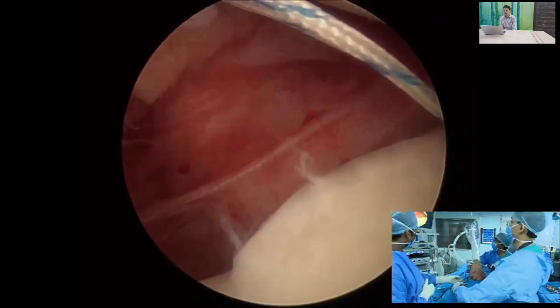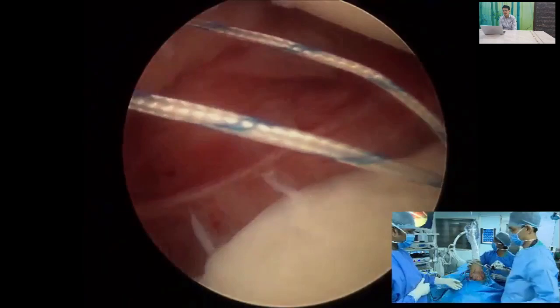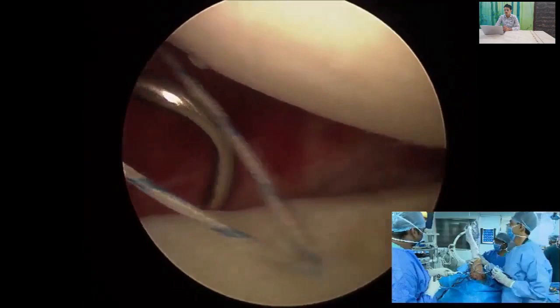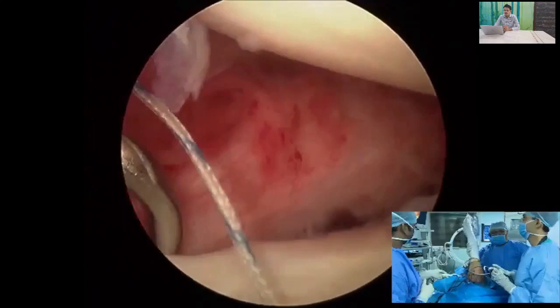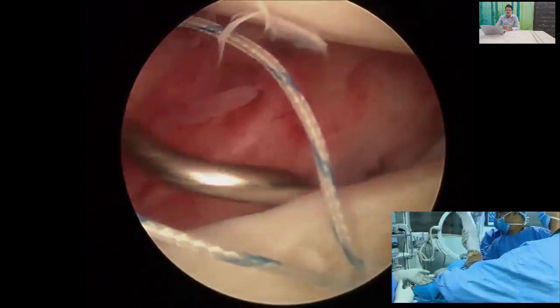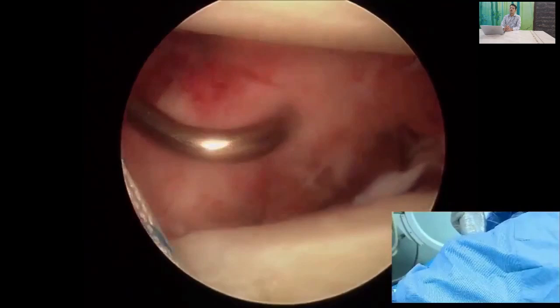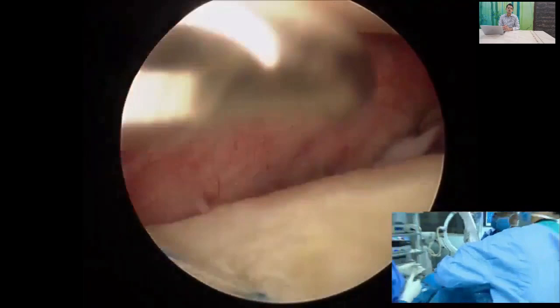Using an ideal suture shuttle or any suture shuttle device, pass through the capsulolabral complex. Critically, the shuttle should pass inferior to the anchor. Pass the capsulolabral complex through the passing device, which should also exit inferior to the anchor. This allows you to achieve a good inferior-to-superior labral shift and provide good stability to the shoulder joint.